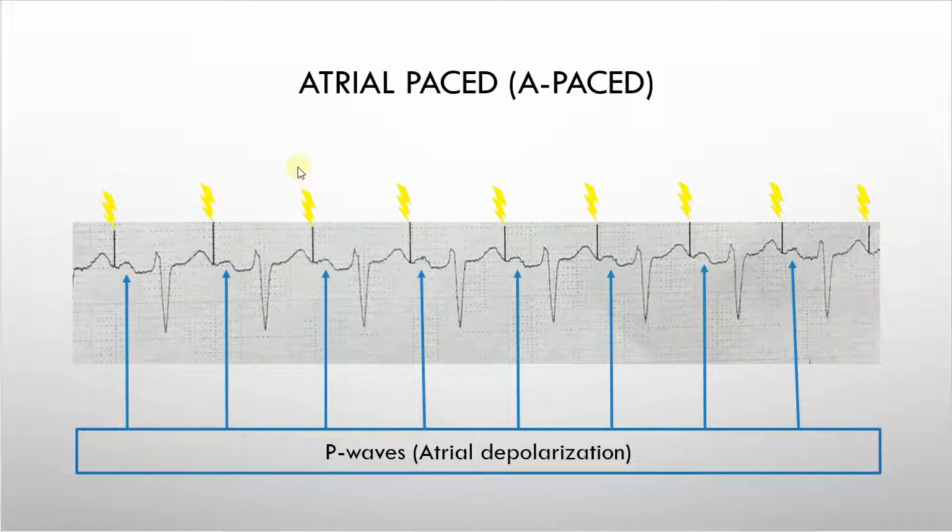And back to our principle that we talked about, that electricity must always come before mechanical contraction, we can clearly see this here. The pacemaker fires, for example, here, and is followed by the atria depolarizing or contracting, and it's quite regular, as you can see over there.